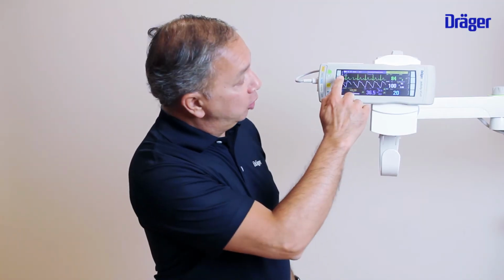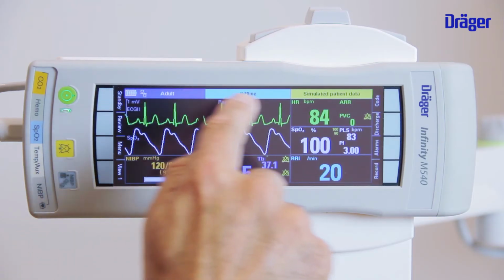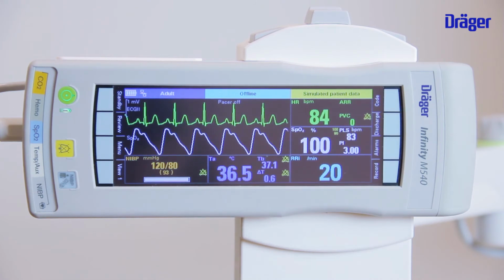On the top you see the message bar. It's in blue over here. You have different information in it. For example, you see network, patient category, bed label, patient name and the time. Sometimes you have a yellow color and there you see a message.